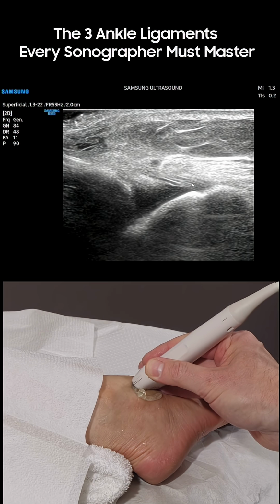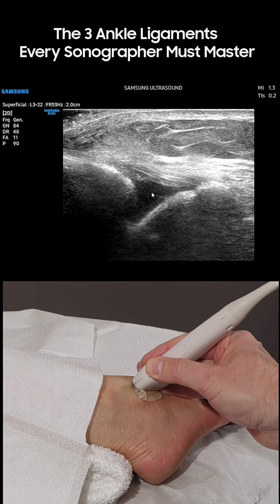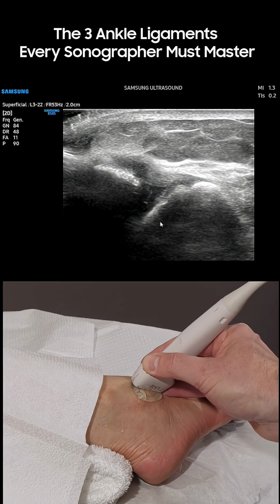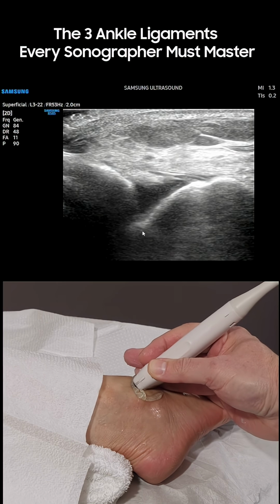anterior talofibular ligament. A little bit of joint fluid here, just a little bit more than physiologic over here, and there's the talus on the right. So that is the first ligament. Again, that is the ligament that's torn most commonly.